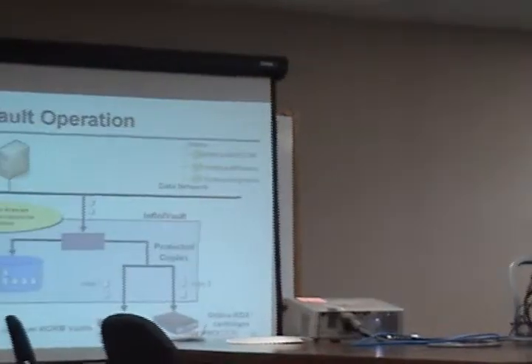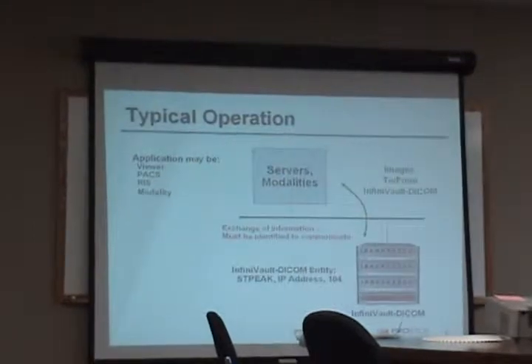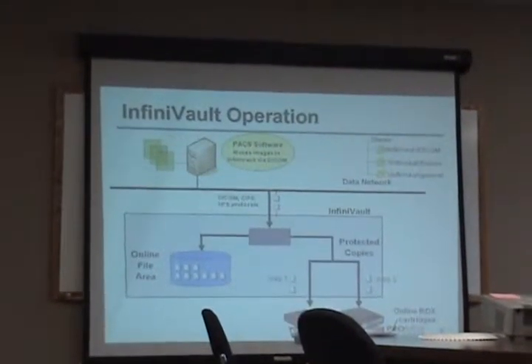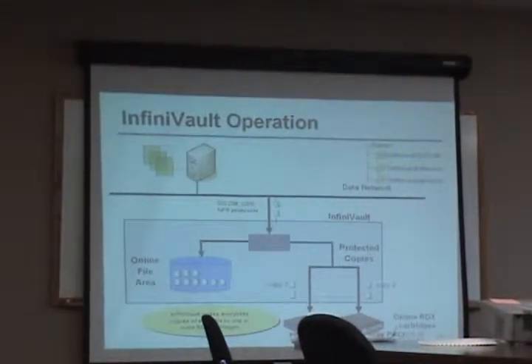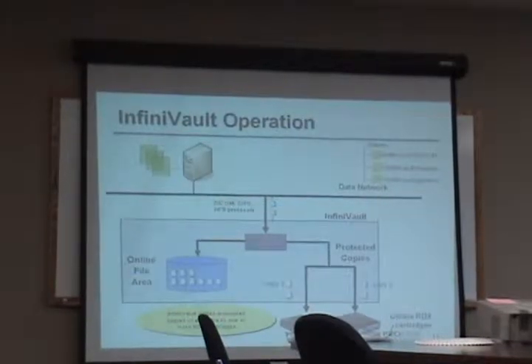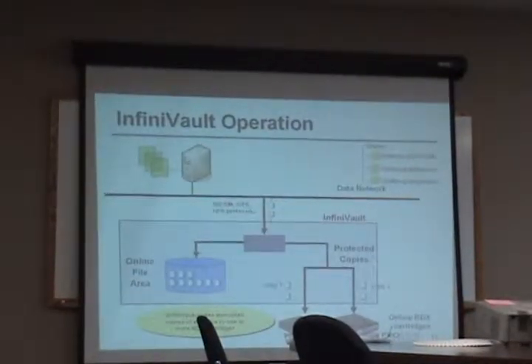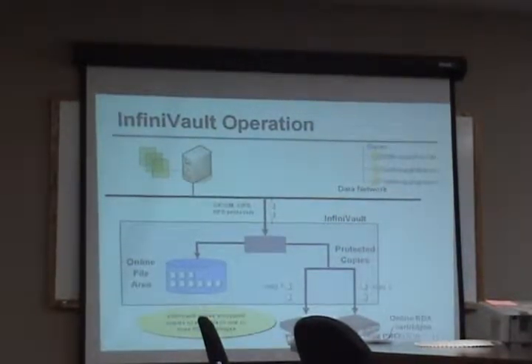Again, HIPAA compliance requires their own vaults. So the STP DICOM vault is set up as a WORM vault by default. That's something that can't be changed. It would be additional vaults that you might set up for some other application in addition to DICOM that you could set as read-write. Again, you could do the test vault, set up a read-write vault, delete all the files, retire the vault, and play around in that fashion.